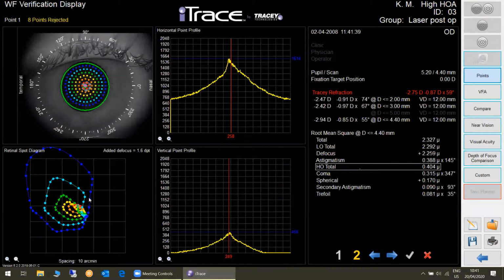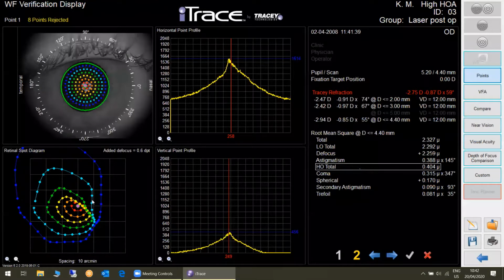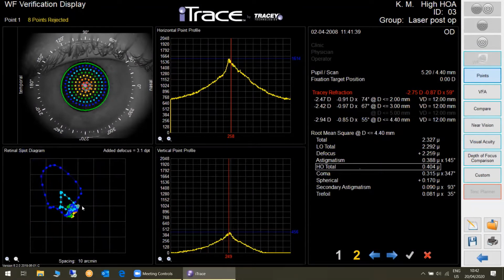Now, the purpose of this webinar today is to explain aberrometry in the simplest way. And most of the time when people hear aberrometry, they run away because it's difficult and they don't understand. It's my goal to explain to you that it's very easy. We see here that this patient cannot be corrected with normal glasses. The normal glasses correct lower order. Lower order are here, and they consist of two parts: defocus, which is the myopia and hyperopia, and astigmatism as cylinder.